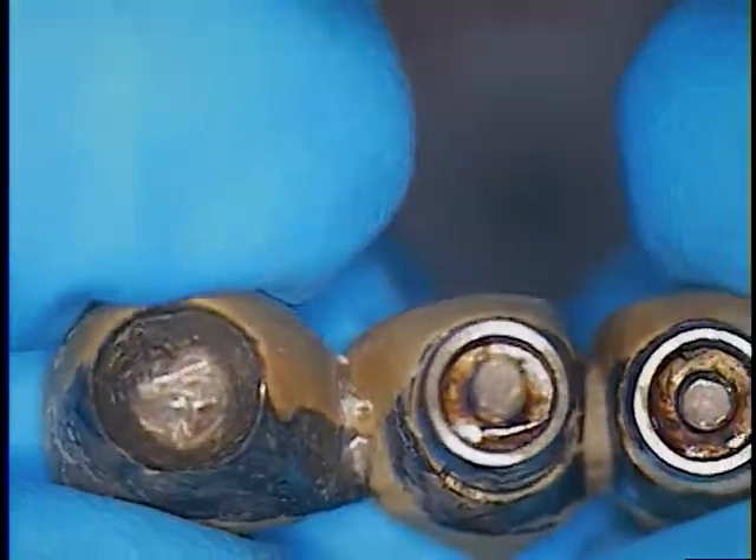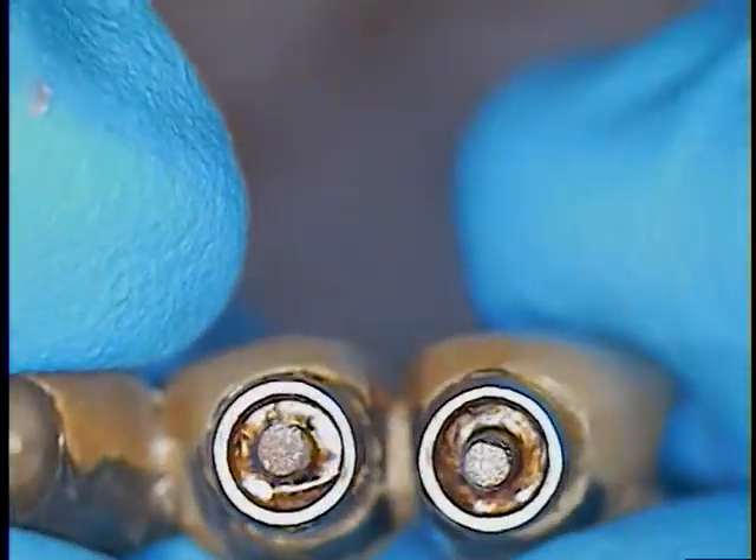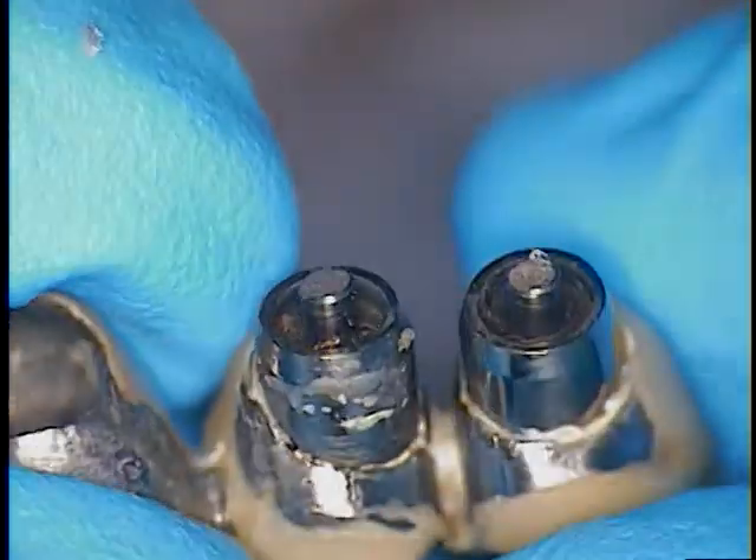The bridge is a cementable bridge, and we now know that because these are the type of abutments where they're stock and not reusable, because there's no retrievable screw now. So let's get the parts out, let's get her back to taking a new impression, and avoid surgery. That's the plan.